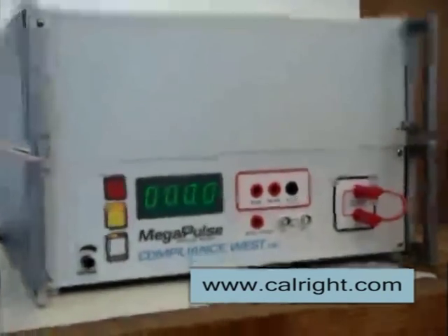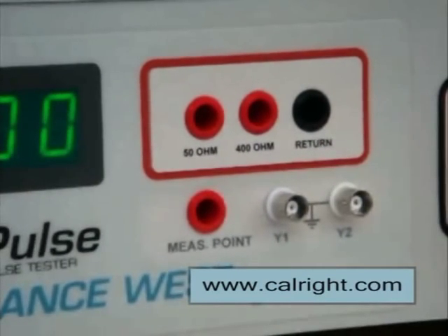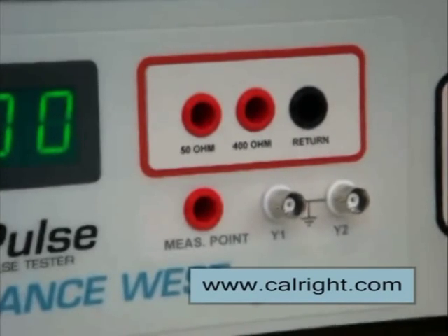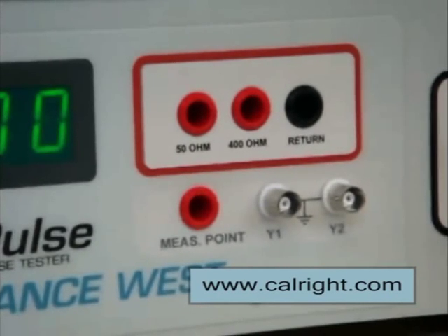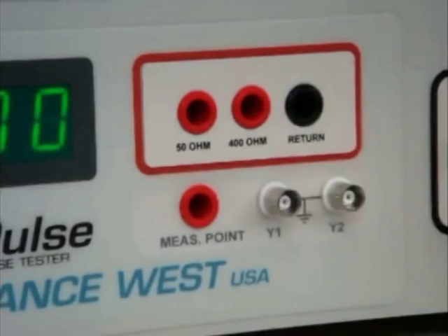Looking at the connections on the front panel of the D-Fib 5, you can see there are three points within the red rectangle. These points are where the 5000-volt pulse is delivered to the device under test, and they are connected to the patient-connected leads of the device under test. Below these connections are two BNC receptacles and one connection labeled measuring point. The two BNCs connect to an oscilloscope, and the measuring point is connected to the signal input and output parts on the device under test.